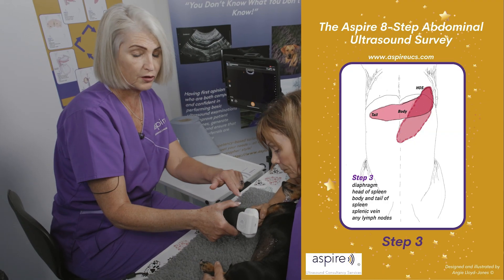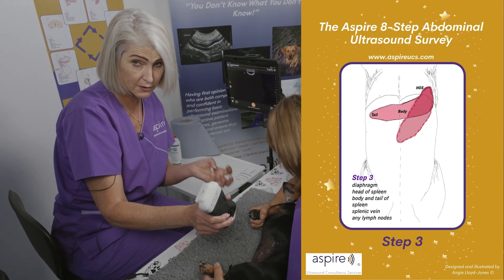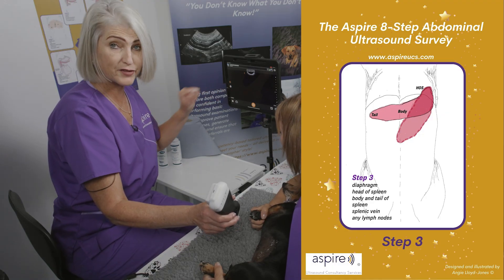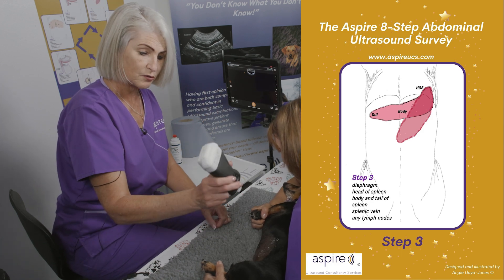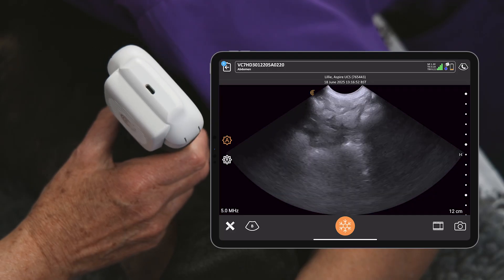Start with the orientation marker once again towards the patient's head for long axis, to pick up that splenic tissue in the first place. That's going to correspond to the left side of the screen, which is the first crystals that are fired when each frame is built. We've got some jelly on Lily already and we're just going to scan down towards the table.